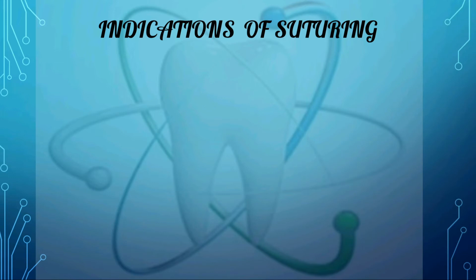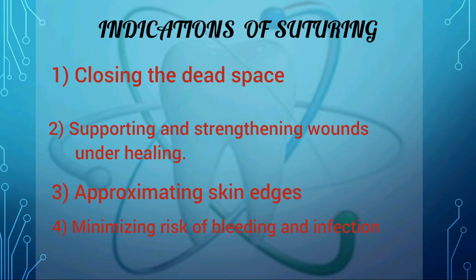Primary indications include closing the dead space, supporting and strengthening wounds until healing, approximating skin edges for an aesthetically pleasing and functional result, and minimizing the risk of bleeding and infection.